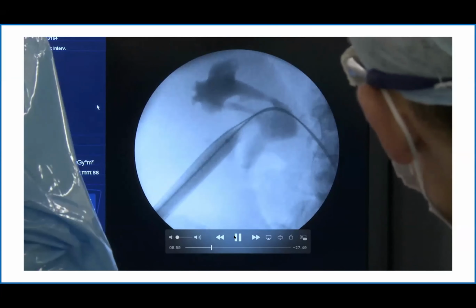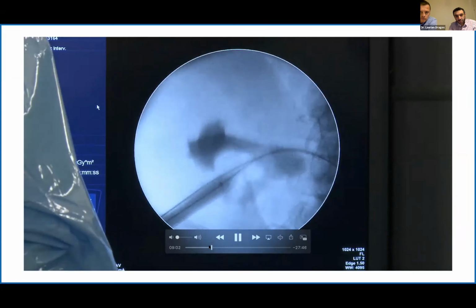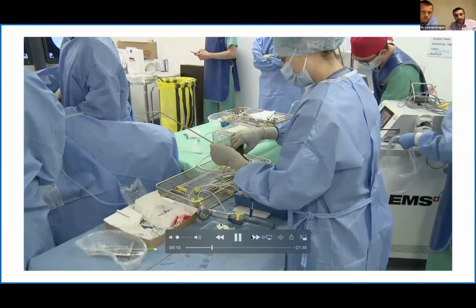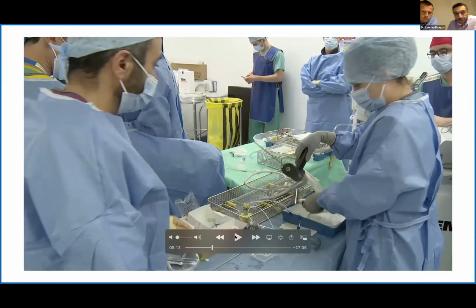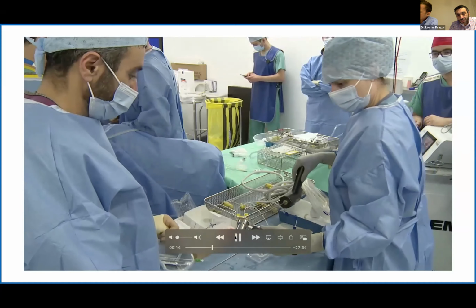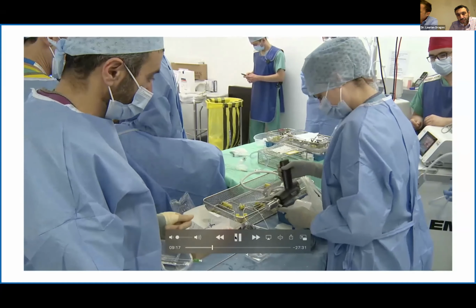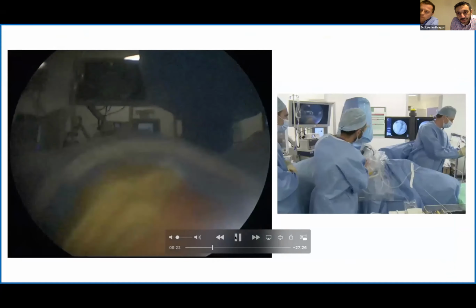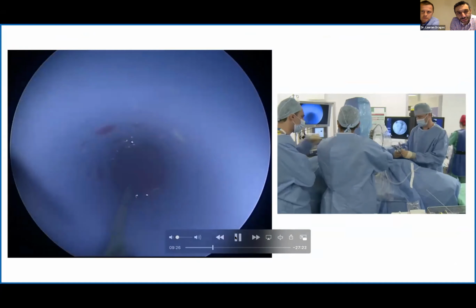Okay. So I'll just slightly fast forward because we've covered some of these aspects. So it's setting up the Trilogy. I quite like the wrench that they have provided, so you don't have to worry about the amount of torque that you're providing to lock the probe. As you can see, it is a quite nice device where you insert it into your probe, and it releases once you've reached the set amount of locking, and it produces a sound, which is quite scary when you hear it the first time because you think you've broken it.